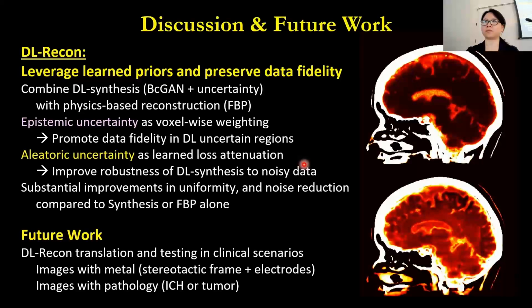The question I had, the aleatoric uncertainty maps looked like there was a lot of uncertainty in the ventricles. And I was trying to figure out why that fundamental aleatoric uncertainty would be higher in the ventricular region versus the rest of the brain. I think we see aleatoric uncertainty high mostly at the tissue boundaries and also in some background parenchyma where there's noise.